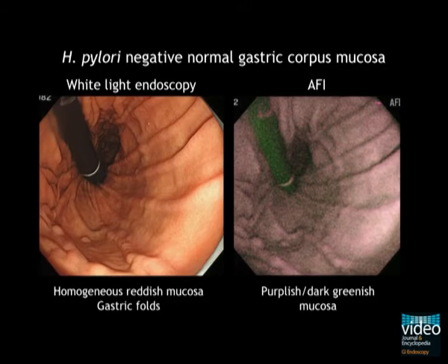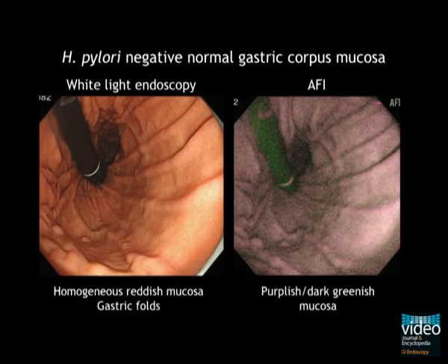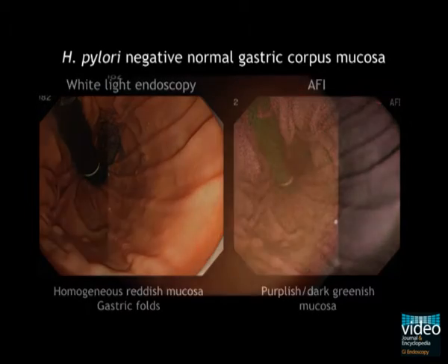Endoscopic findings of H. pylori-negative normal gastric mucosa are now explained. In white light image, H. pylori-negative mucosa looks homogeneously reddish and gastric folds are well preserved. In AFI, it looks purplish or dark greenish in colour.